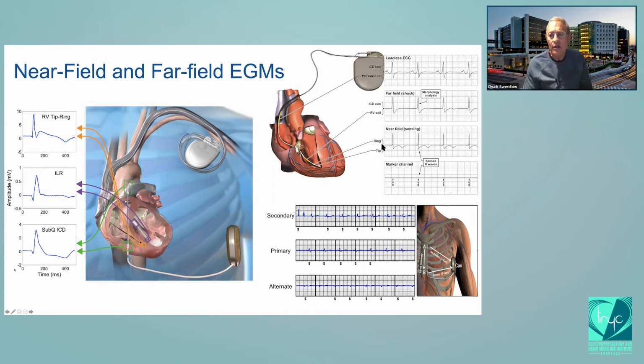And then also to remind you that in a defibrillator, the sensing signals are either off the tip electrode and an electrode close to it, either the shock coil or a dedicated ring electrode used for sensing, as in pacemakers. But the defibrillation signals are what we call the far field signals. That means they're not close to the heart.